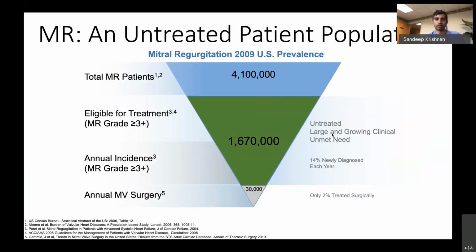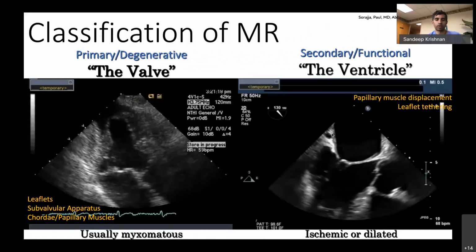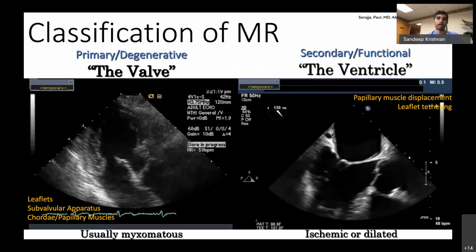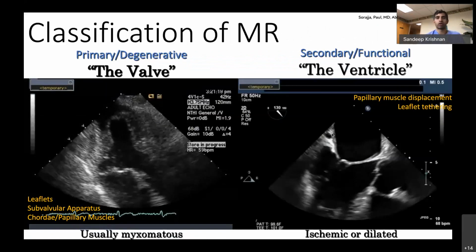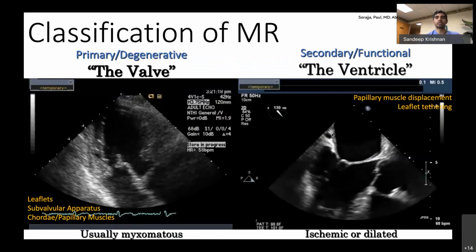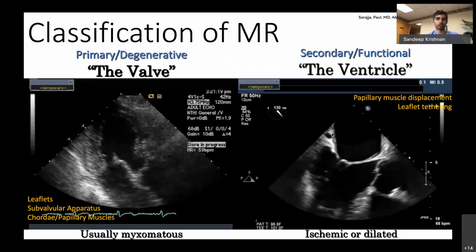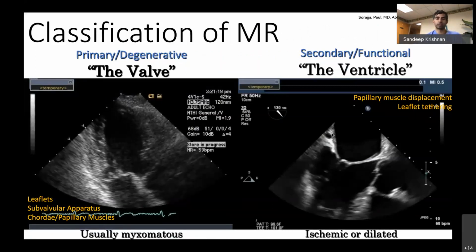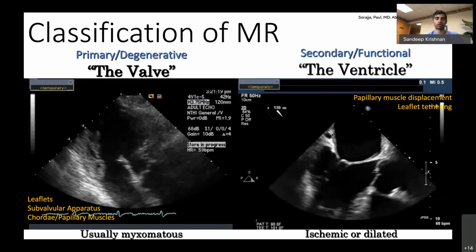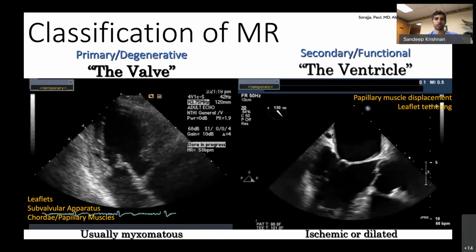So that's why I wanted to spend a lot of time talking with all of you and getting you comfortable with this pathology, and also getting you to think a little bit outside of what the protocol is. I mean, we want you to stick to the protocol, but there's no harm in taking extra pictures. If you see something that looks interesting in the echo, spend some time and investigate it a little bit and show us, tell us a story. When I say us, I mean whichever cardiologist you have assigned to read that echo, tell a story.